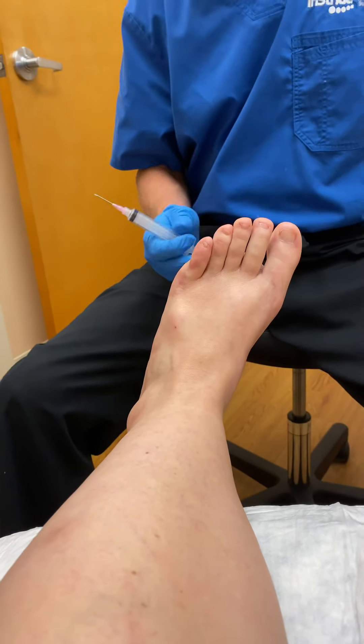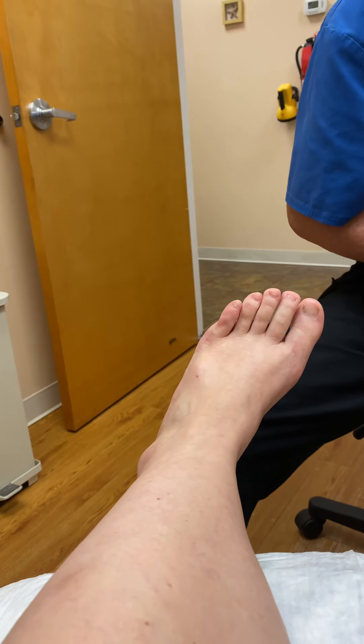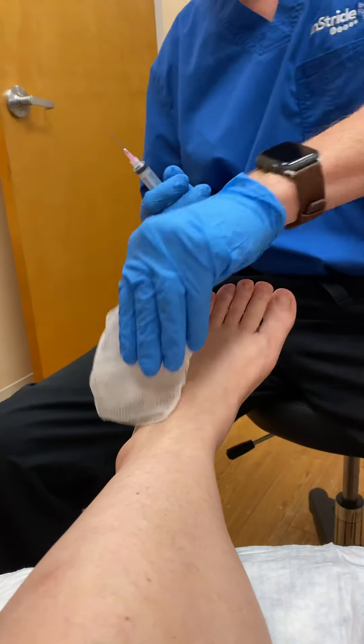We have a suspected ganglion cyst of the foot, based upon ultrasound imaging and clinical impression as well as the patient's history.